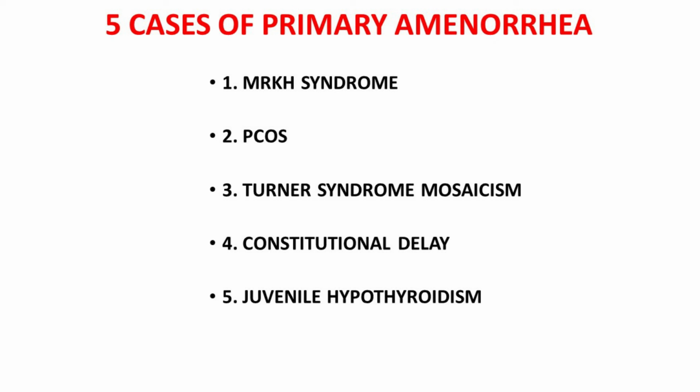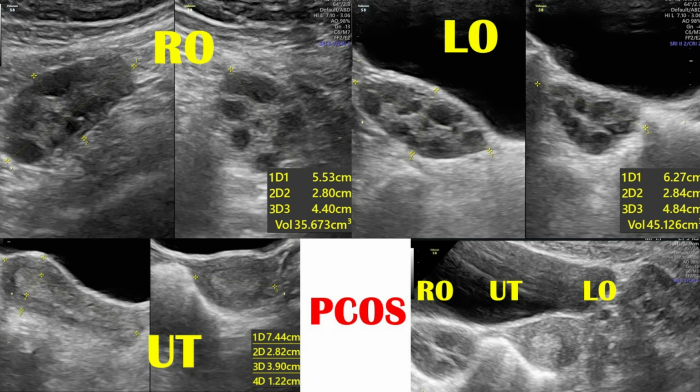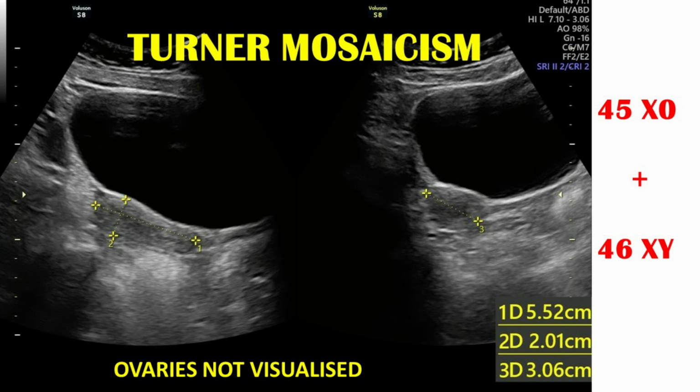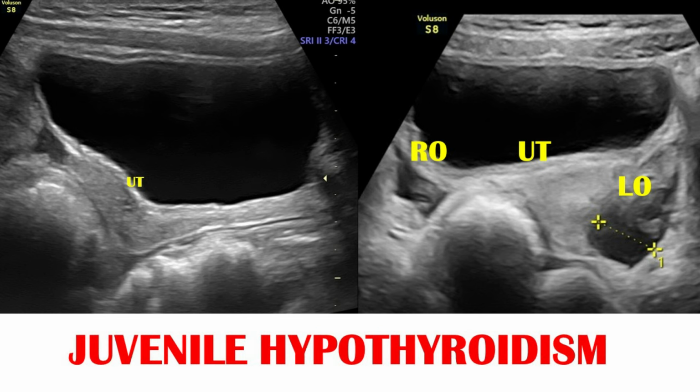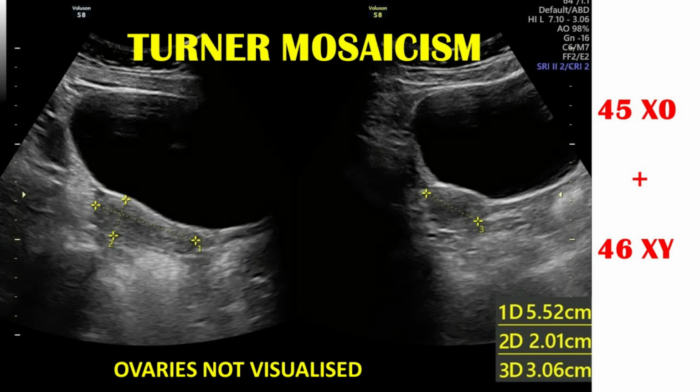Ultrasound is the first and superb modality of choice to diagnose primary and secondary amenorrhea, as PCOS is now blooming exponentially in this decade, especially in our Indian subcontinent. Turner syndrome is one of the most common diagnoses of primary amenorrhea in the pubertal age group, with high suspicion on ultrasound but not specific for the diagnosis, as constitutional delay and endocrinological pathologies mimic almost the same, and hence hormonal analysis and MRI sometimes may be needed, and sometimes karyotyping also, for the final diagnosis of Turner syndrome. And mosaicism nowadays is diagnosed more commonly due to more karyotyping these days.